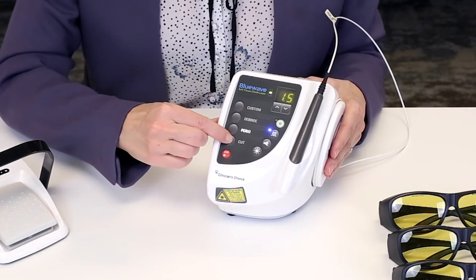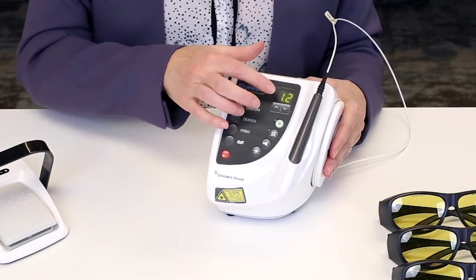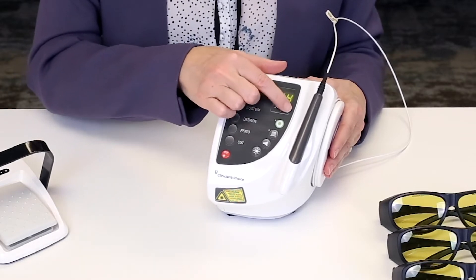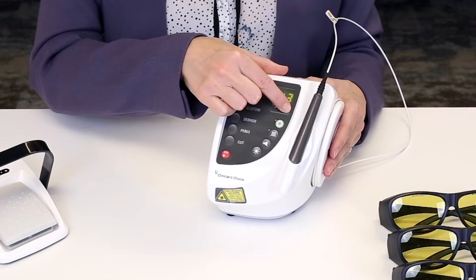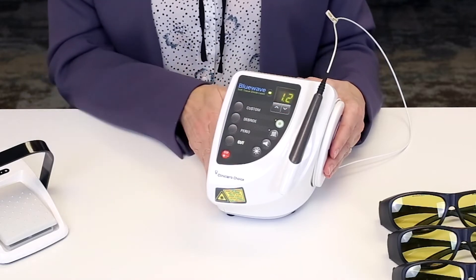Finally, here is the cutting mode, preset to 1.2 watts. You can adjust it if certain tissues need to be ablated at a higher speed, or you can leave it on the standard.